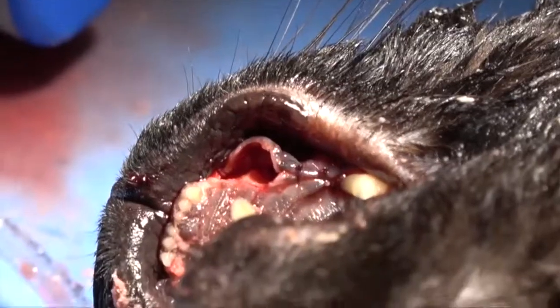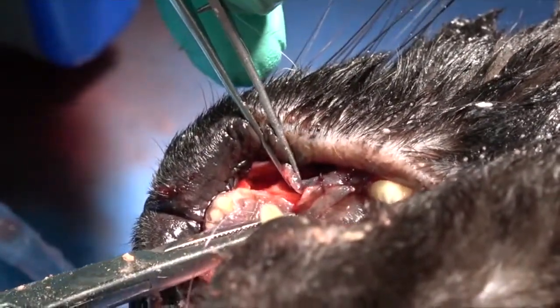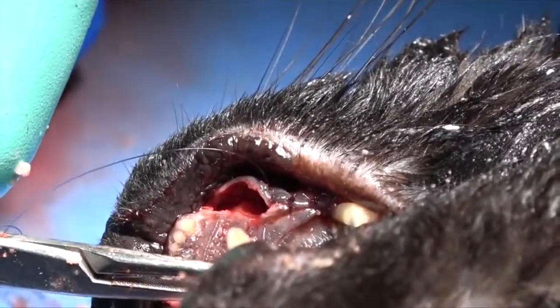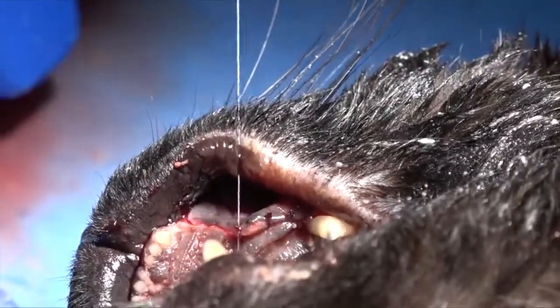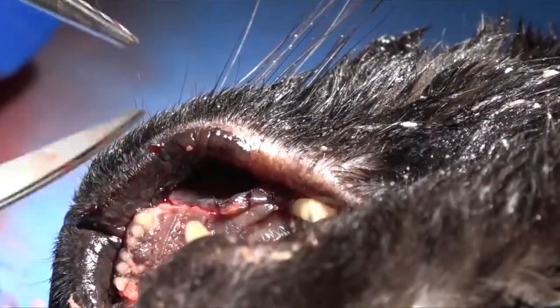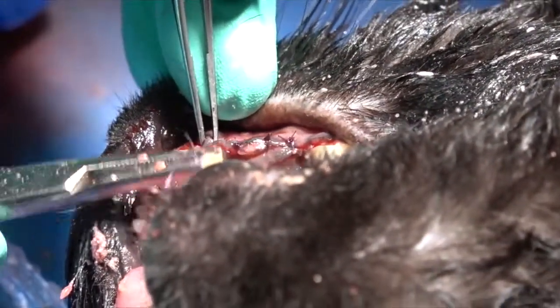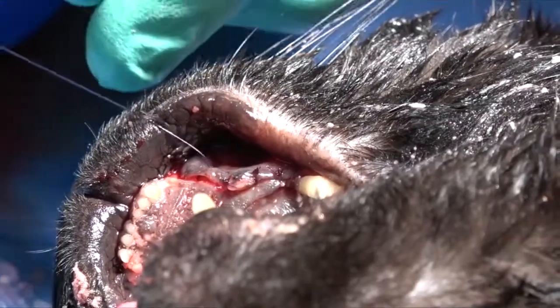We move distal to mesial when we suture any oral surgery closure. The reason for that is, in most cases — especially if you're doing a vertical releasing incision — that incision will be mesial, and so that allows for a lot of unattached gingiva at the end of suturing to give you a little bit more resiliency. If we finish and find that we need a little bit more tissue, all of that on the mesial releasing flap is unattached gingiva and can be pulled down to close the defect completely.